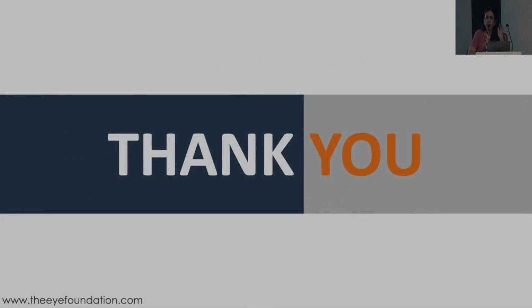So essentially, what you need to understand from my talk is that on-axis incision is not needed nowadays. There are limbal relaxing incisions and arcuate keratotomies, which are okay to debulk the astigmatism, but they are not very precise. Today we can do a toric IOL even for a small amount of astigmatism, even 0.75. Why do you want to correct small astigmatism?